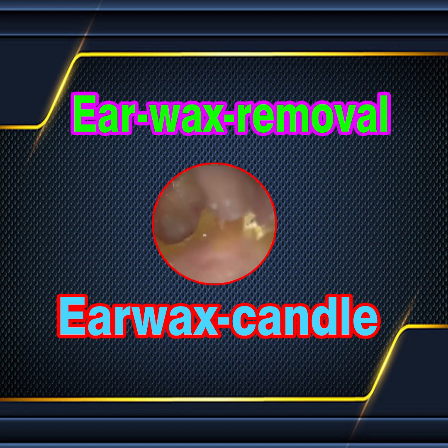The fogging is due to the patient's otitis externa. When there's an infection, your body responds with inflammation, which increases the temperature in an attempt to fight off the infection, and that can cause condensation on the lens of the endoscope. But as soon as you enter with the suction probe, it demists the fogged lens of the endoscope.